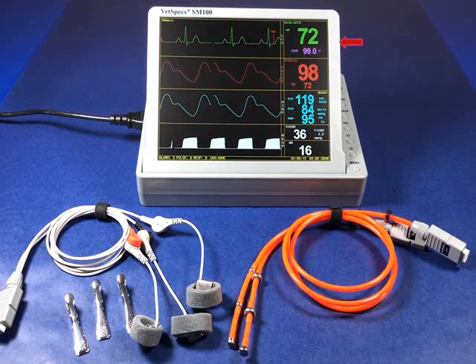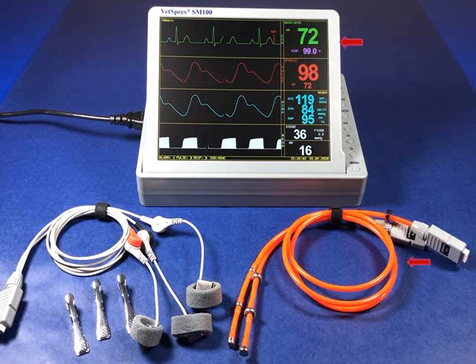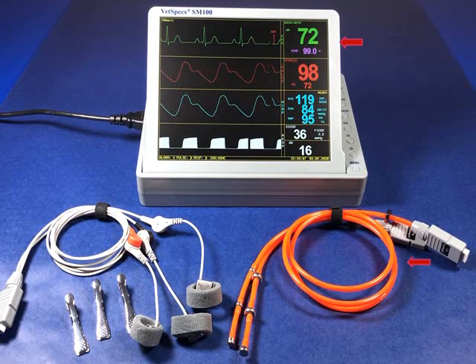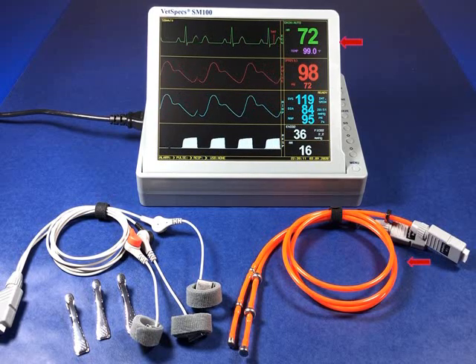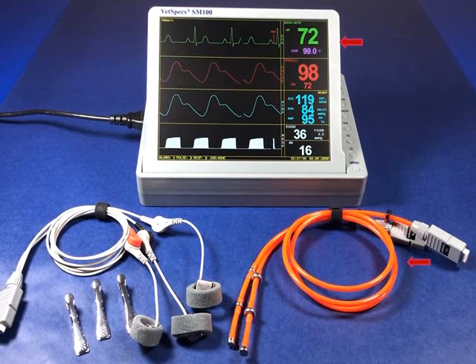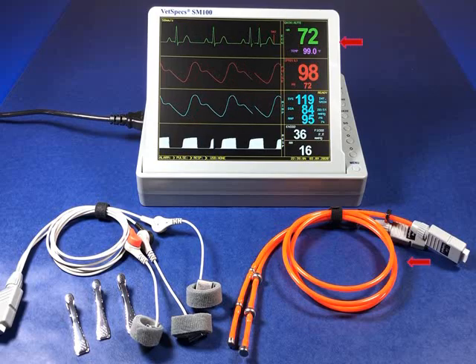For intubated patients in surgery, the SM100 comes standard with two different sizes of our prized esophageal probes providing both ECG with heart rate and highly valuable core body temperature. As a single, simple insertion, the esophageal probes register desirable ECG waveforms due to the natural conduction in the esophagus and because of the proximity to the patient's heart.